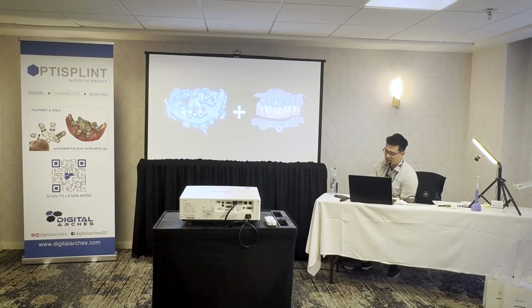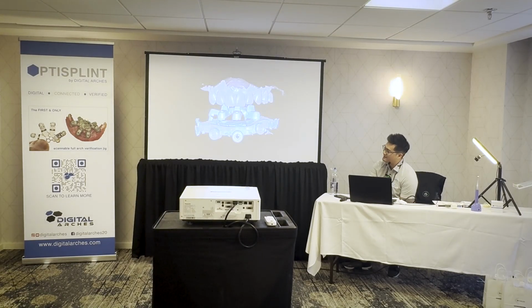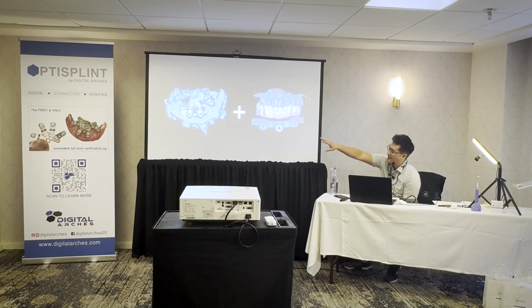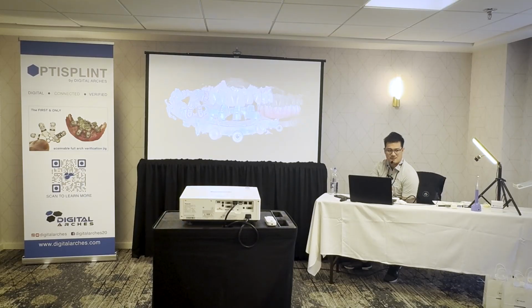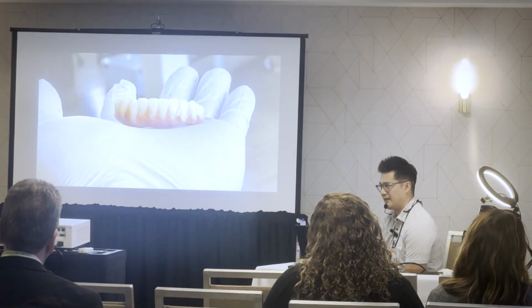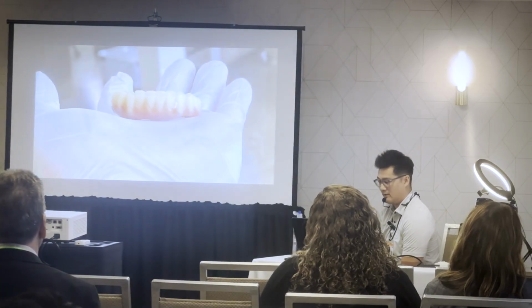And so it's very simple. You just merge your scan body with your bone reduction guide. And then all we do is we just add these positions to our temporary. That's it. This process is literally a 10-minute thing because this case already existed in exocad. All I did was I took that, I imported it as a scan body scan, I merged it to that, and I just added my tie bases. It's super easy. And so this was printed. This was on a Straumann printer with GC temp resin. And then she came back the following afternoon, and then we delivered the case.